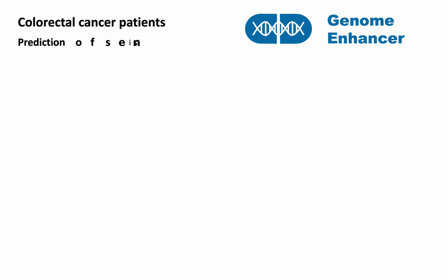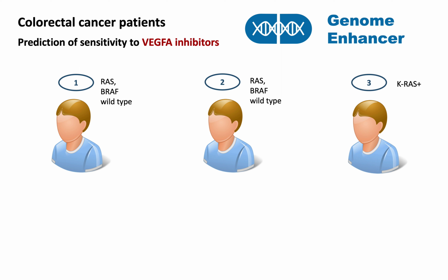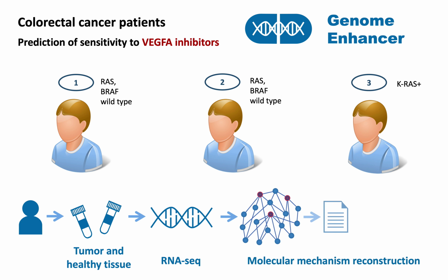In this video, we will show you how Genome Enhancer results can be interpreted for further use in clinic on the example of sensitivity prediction towards VEGFA-targeted therapy for 3 colorectal cancer patients.